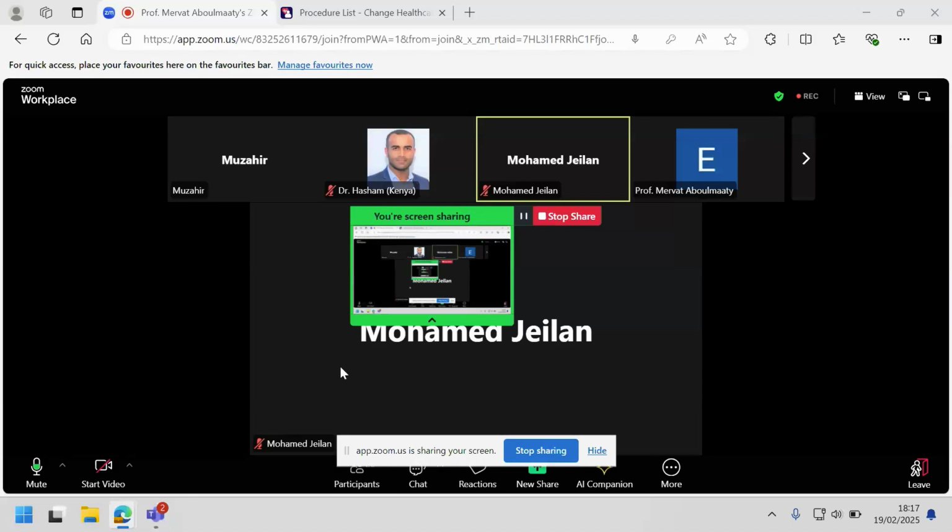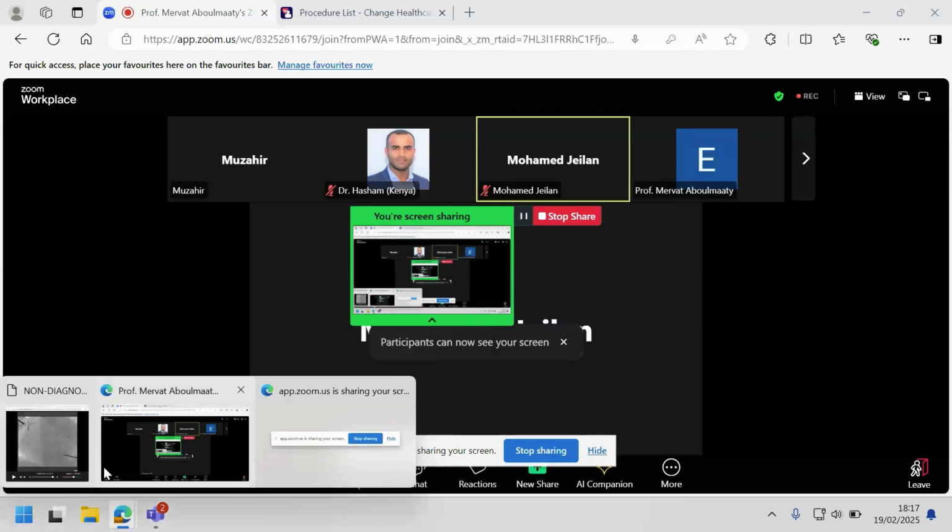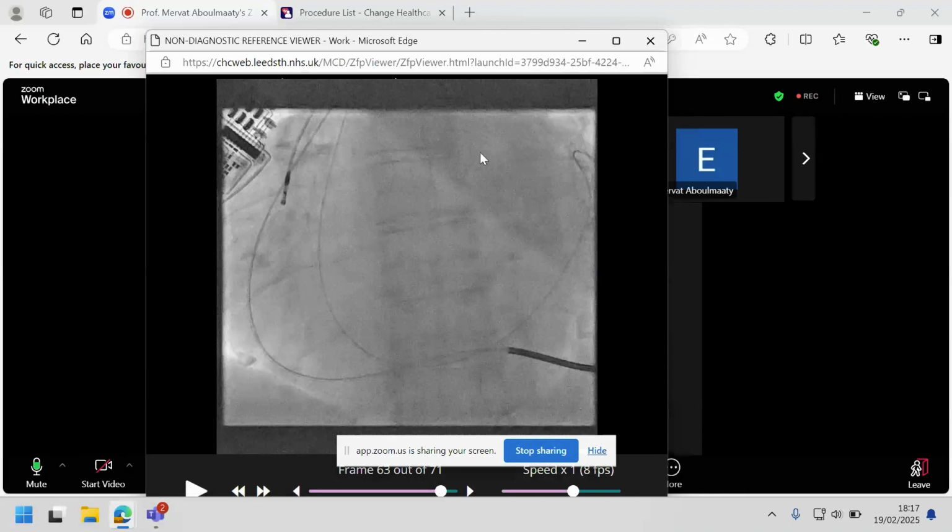I don't know if I can show you this one video. This was a case where we had a right-sided device. Can you see that? Yes, we see it, Muzahir.